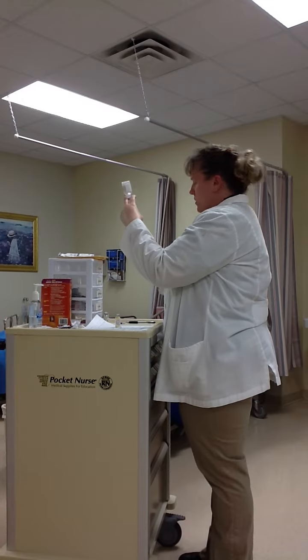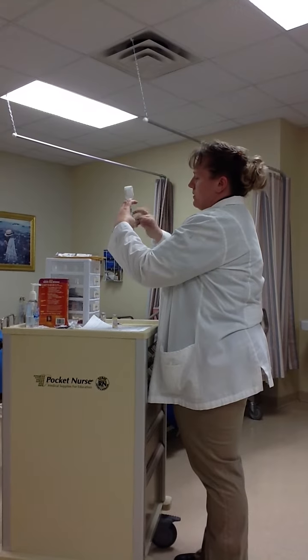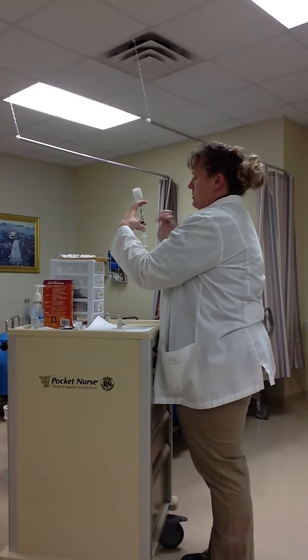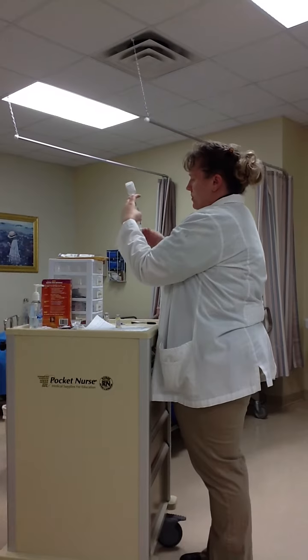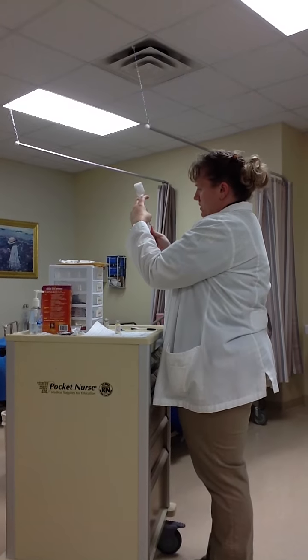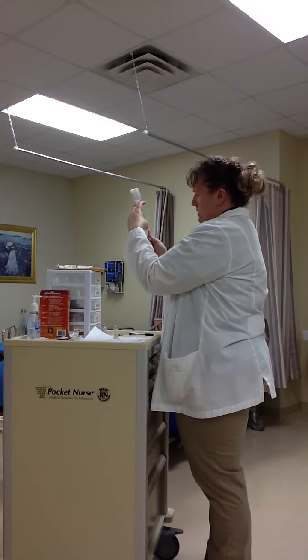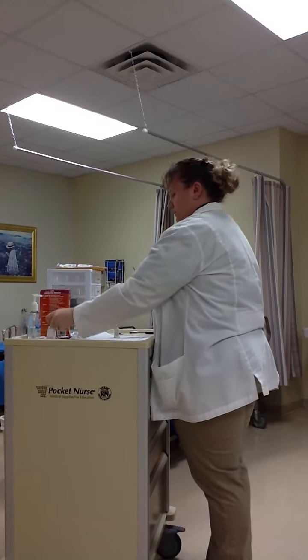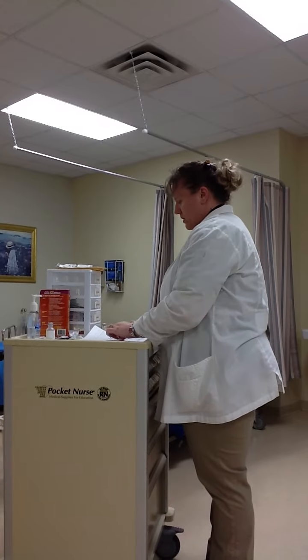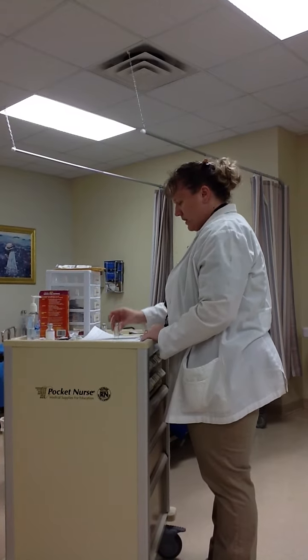Now that I have that where I want it at 5.6, there's bubbles, so I want to make sure I get rid of those. I'm going to tap that. Make sure all of my bubbles are out. And I'm going to remove that. I'm going to set it to the side. I'm going to recap this just to set it to the side for just a second, make sure that I have everything that I need.